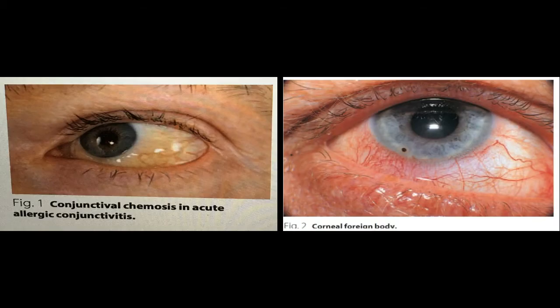Examine the cornea bilaterally for irregularity, scars, hyperemia, and haze.